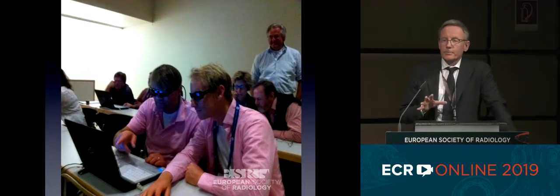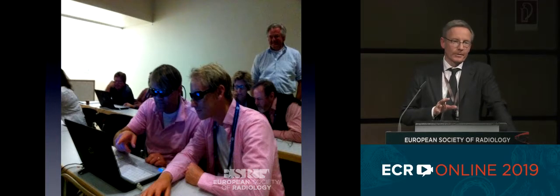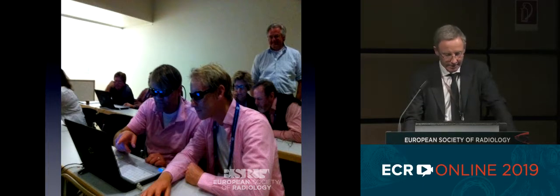Finally, please put yourself in good viewing conditions when reporting the chest radiograph. Avoid interruptions, avoid fatigue, don't wear sunglasses. That doesn't help interpreting the chest X-ray.